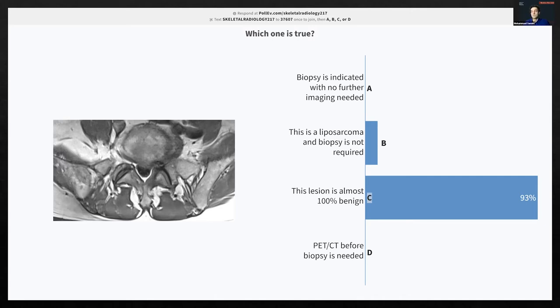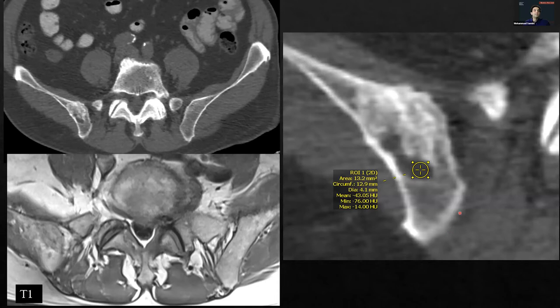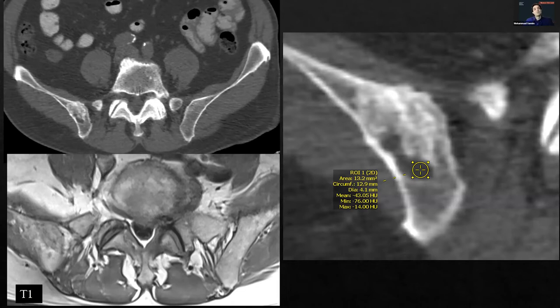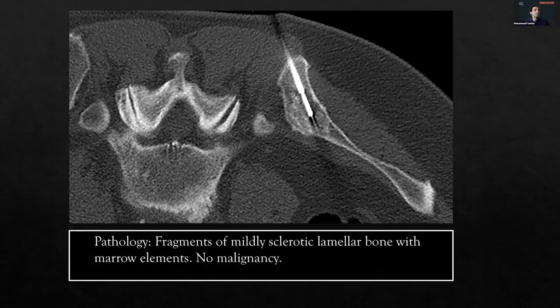The old saying for the radiologist is that the prior is your best friend — go back as long as you can and see if this is a new lesion or not. Almost all of you selected the right answer. This is an intraosseous mass with no aggressive imaging features — no cortical breakthrough, no cortical destruction — and it has an internal fatty focus with a Hounsfield unit of minus 43. Studies have shown that an intraosseous mass with internal fat and no aggressive features is 99% — almost 100% — benign, so this lesion really does not need biopsy.